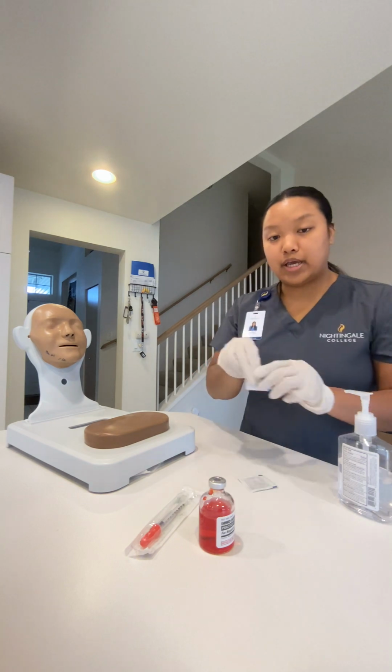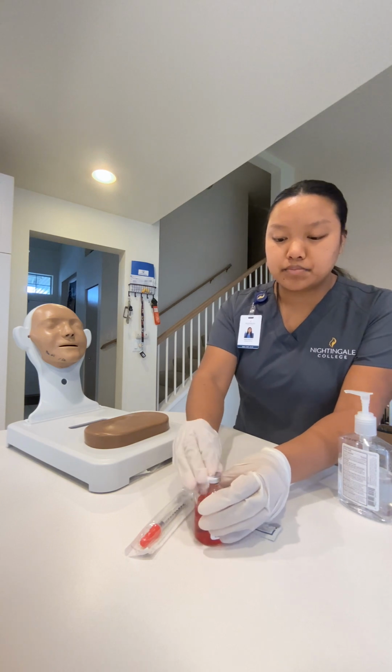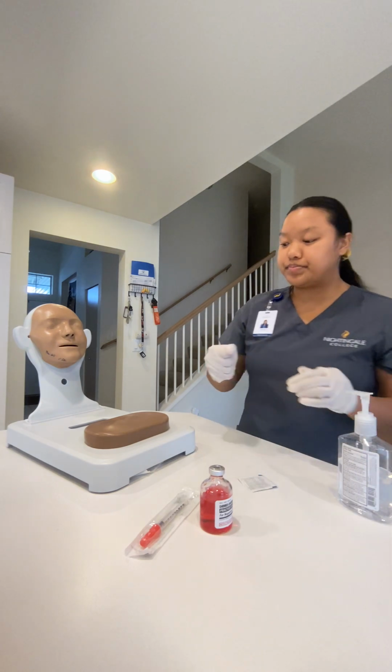Okay, I'm gonna get my alcohol swab, and I'm gonna go ahead and clean the top of the vial. I'm gonna make sure that's dry. Toss all this stuff out into the garbage now.